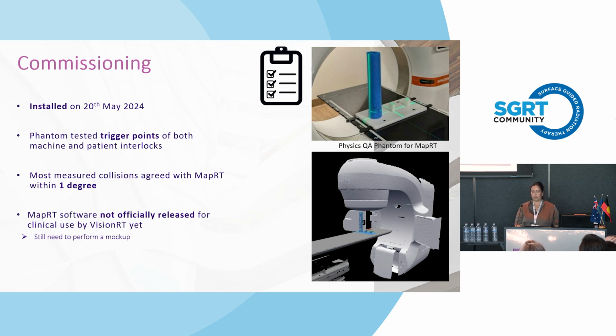However, because MapRT software isn't officially released for clinical use yet by Vision RT, and Peter Mac Moorabbin is one of the beta testing sites for the program, we are still encouraging our staff to perform a mock-up procedure if they are concerned at all about a clearance. However, these initial results are very promising.